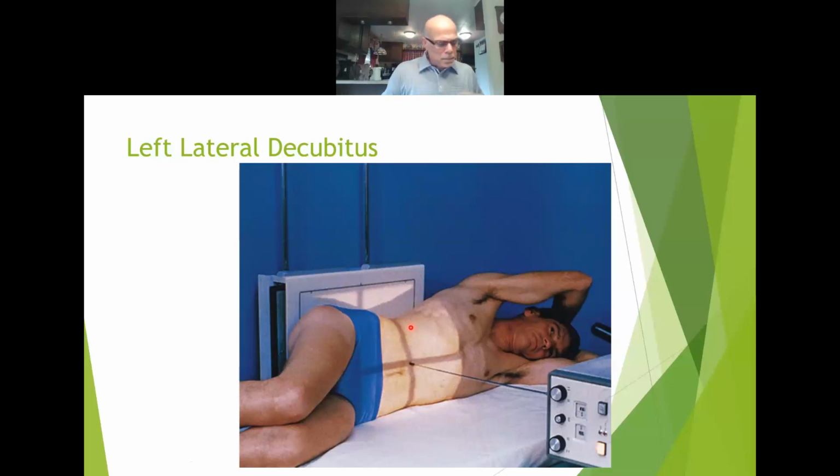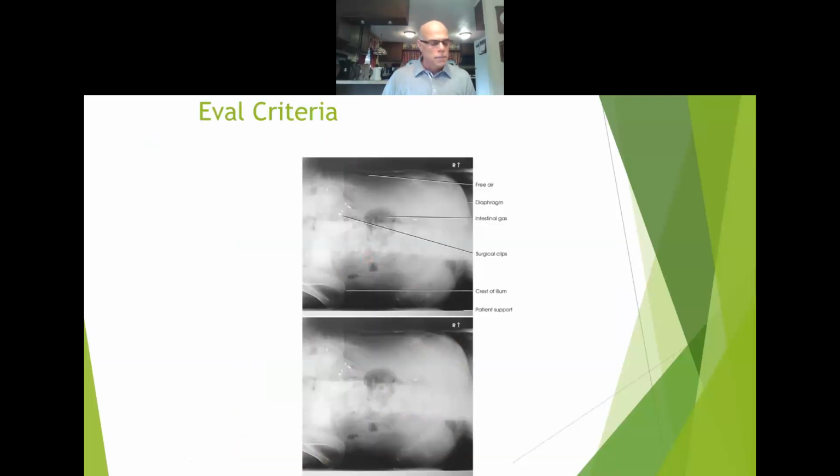All right, structure shown. Let's see if we got an image of that. I think I do. Okay, right here we got size and shape of the liver, spleen, and kidneys. AP abdomen with the patient in the left decubitus position is most valuable when showing free air and air fluid levels when an upright abdomen projection cannot be obtained. So it tells you the AP patient in the left decube position is most valuable for showing free air.